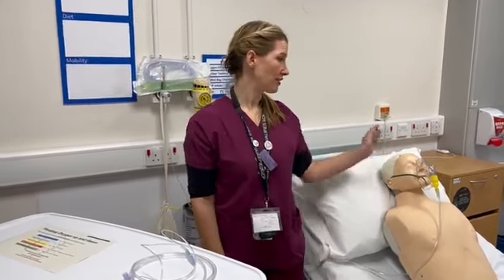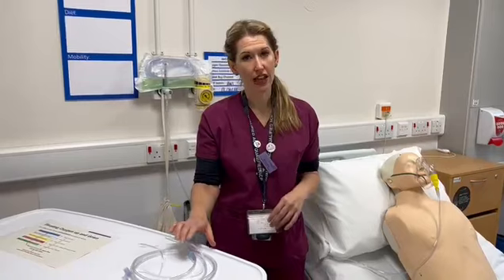I'm one of the respiratory ACPs working here at Harrogate Hospital. This video is going to go through how to convert your patient that's on Venturi to the nasal cannula.